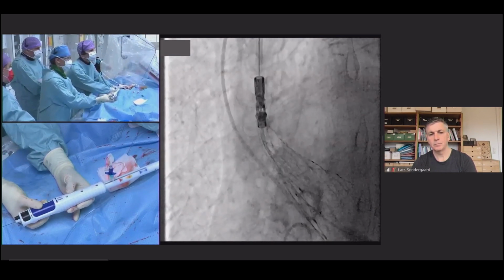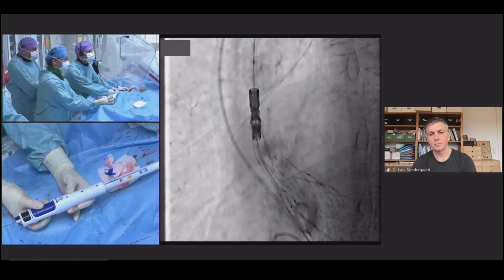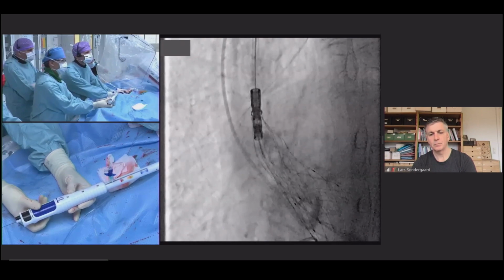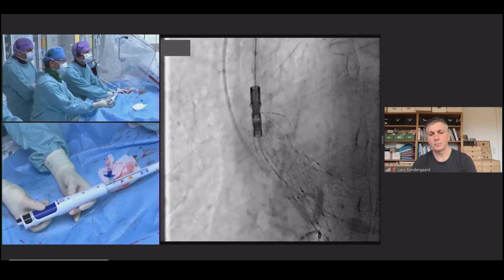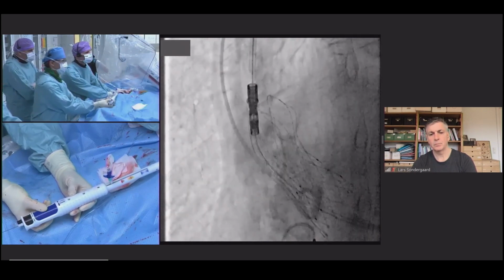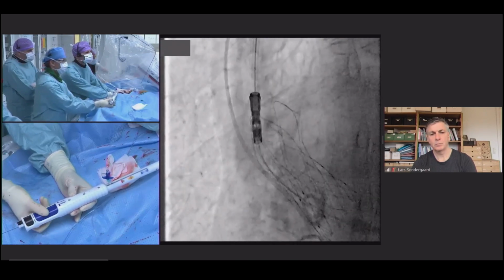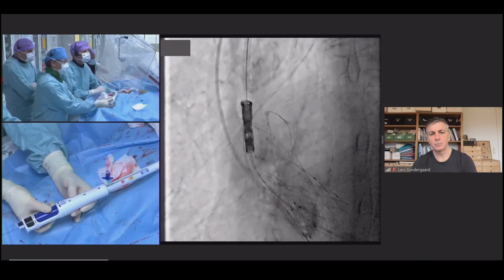Pressures are coming back. And we want to see those 3 tentacles coming off. I can see 1 is off now. I'm at a hard stop. You go to full stop.